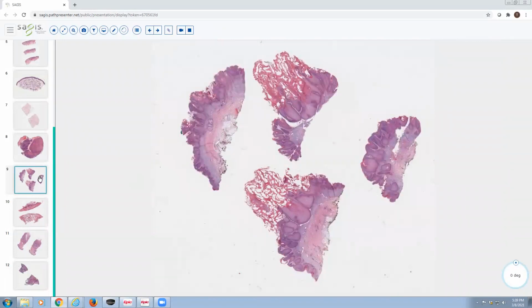Okay, so now we are moving out of the adnexal tumor category into kind of a little bit more of a mixed bag here. The diagnosis for this next slide, number 9, is crusted scabies. And crusted scabies is a variant of scabies in which the number of mites in the cornified layer is a lot higher than your typical presentation of scabies. So in a normal presentation of scabies, the patient may have like 10 to 12 mites on them. In crusted scabies, it can be literally hundreds.